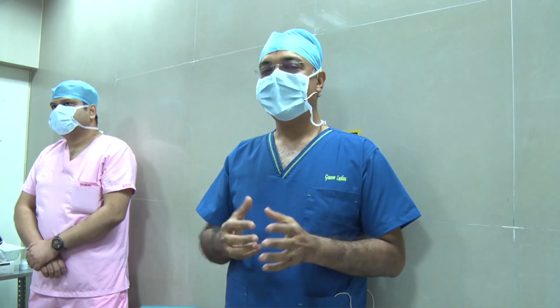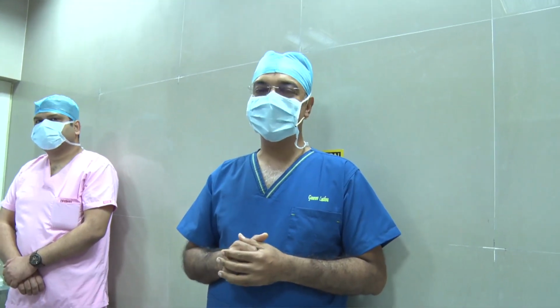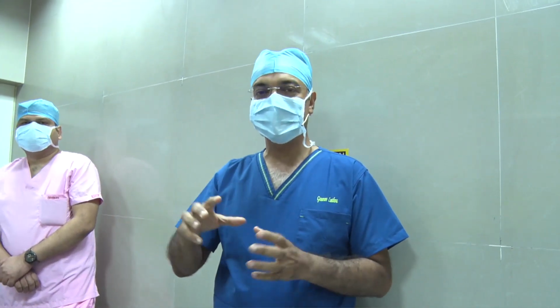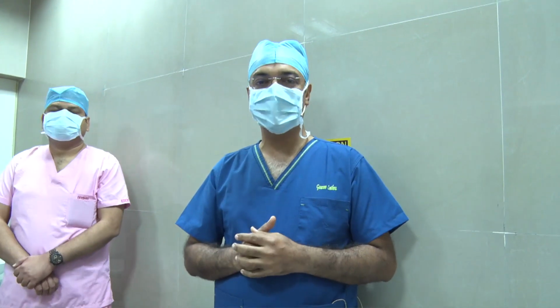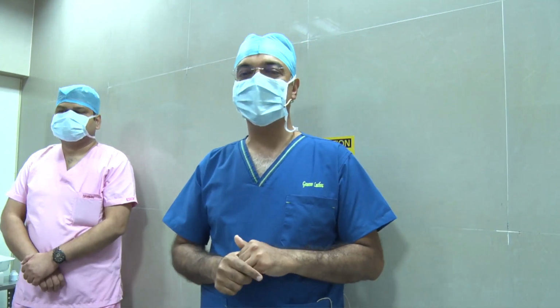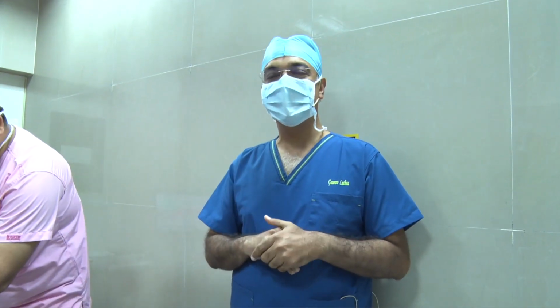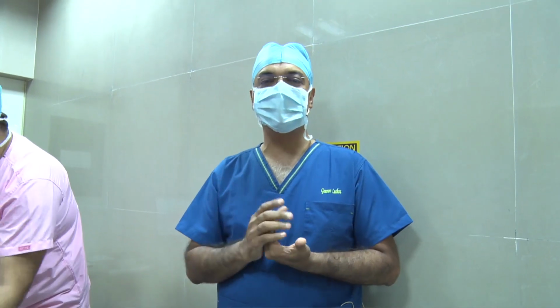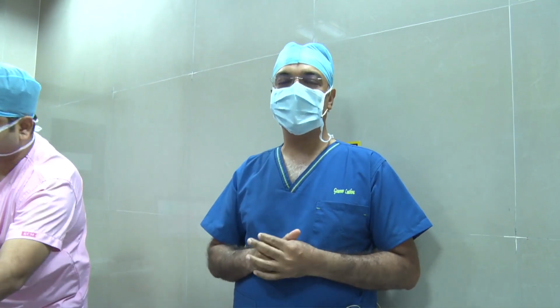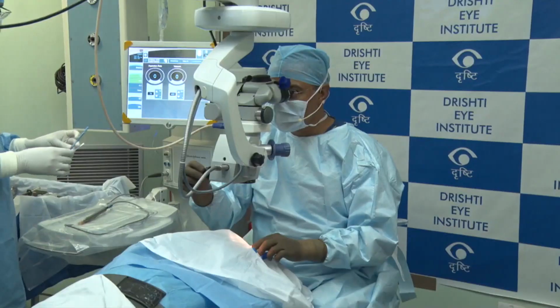Only in a very rare case, again in subluxated cataracts where the bag is mobile, you can get a rexis very nicely without having to do the rexis manually, where you may move the bag quite a bit or the lens quite a bit. So these are some of the indications, and also with multifocals and all where you need highest precision of the rexis and of your LRIs, they come in very useful. So small astigmatism of 0.5 to 1 diopters, without using a toric lens, I can correct it with the LRIs. So I think we'll move on to Dr. Rishi Swarup.